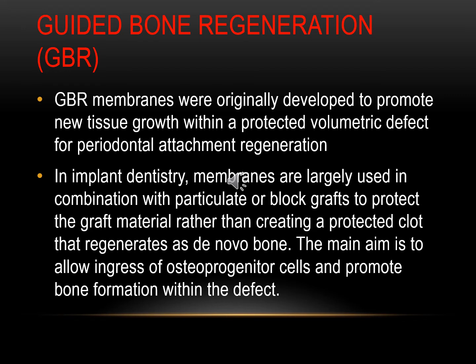The main aim of GBR procedures is to cover the bone graft, prevent soft tissue formation inside the bony defect, and fix the bone graft in place and prevent it from movement during the healing and the formation of the bone inside the bony defect.